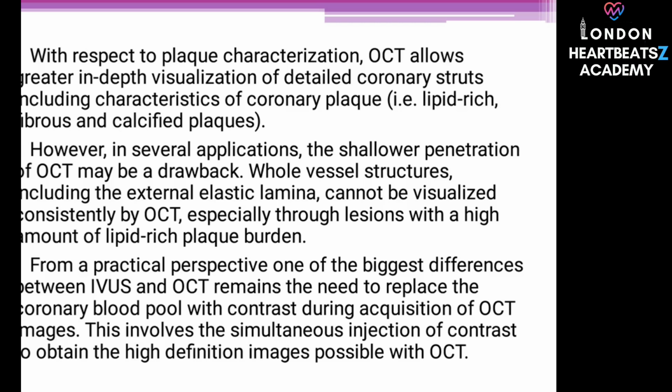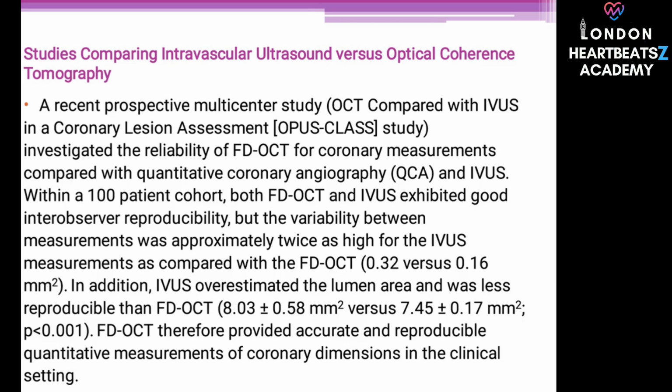The IVUS catheter can sometimes occlude tight lesions, potentially causing ischemia with slow pullback. Standard grayscale IVUS has limitations in detailed tissue composition assessment. Can't always tell exactly what the plaque is made of. Right, and it lacks the resolution to precisely measure calcium thickness or accurately assess subtle stent malapposition, small edge dissections, tissue prolapse through struts, thrombus, and endothelial coverage over the struts. Limited resolution for those fine details around stents.